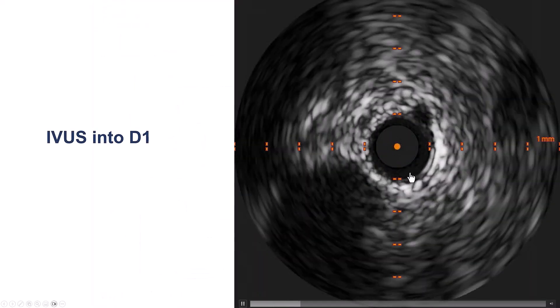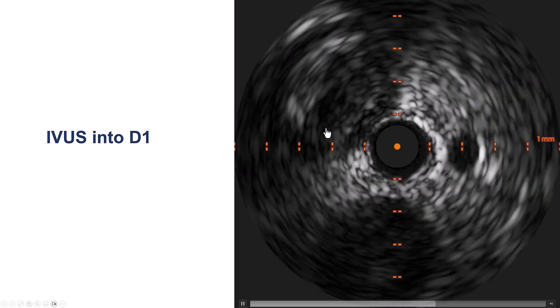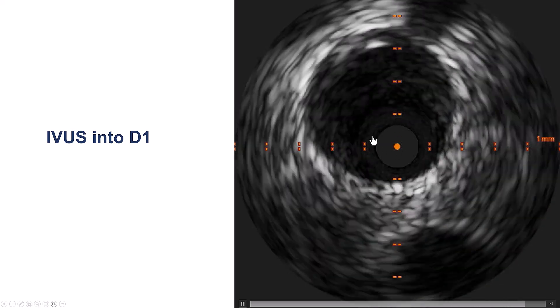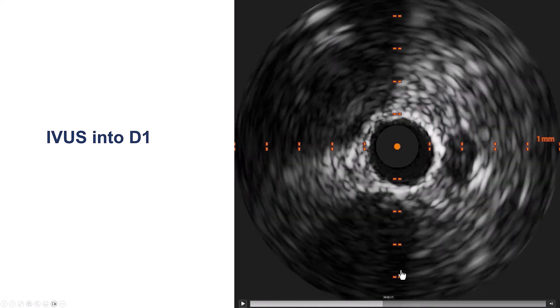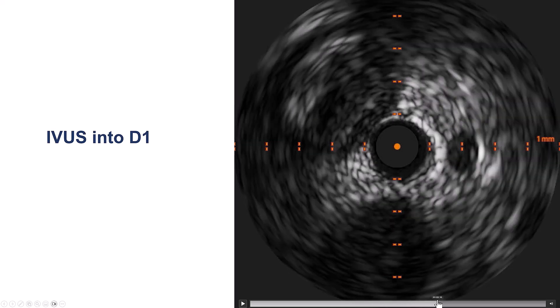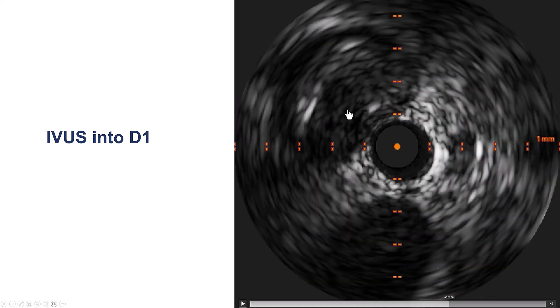This is the IVUS pullback. We advanced the IVUS into the diagonal branch and are now pulling back — we can see the vessel here. This is the LAD, and now we are in the LAD proximal to the occlusion. This is probably a cardiac vein. Coming back slowly, this is the LAD, this is the diagonal. There is no significant calcification in the LAD, which makes it very favorable for antegrade wiring.